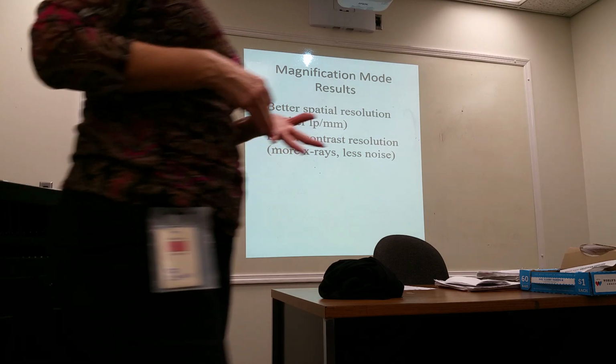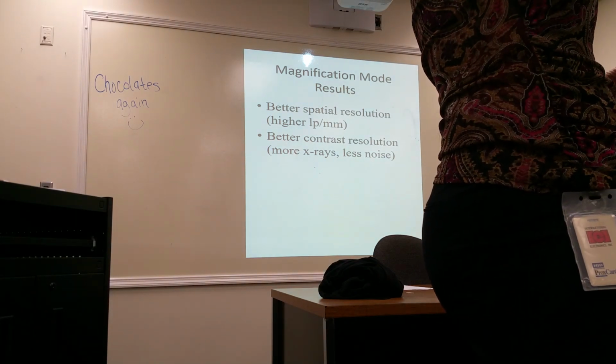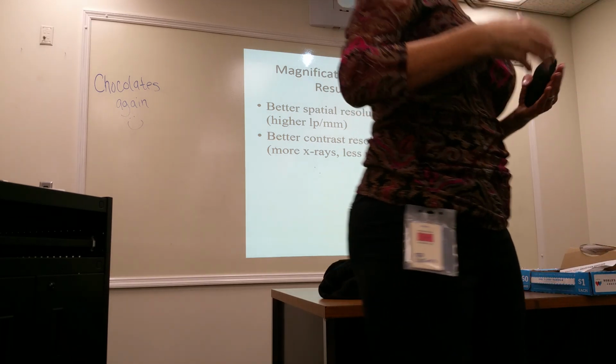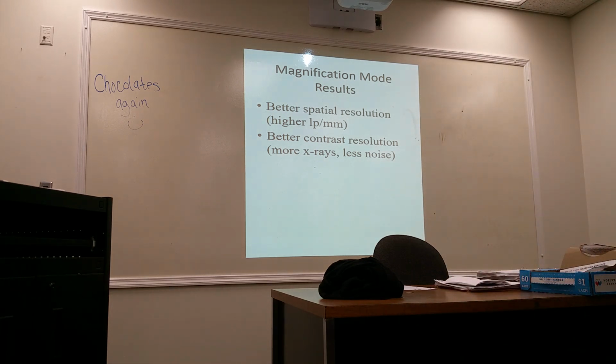And isn't that true in CT also? That's where they get in trouble in CT, because the higher the mA, the better the image resolution is. Whoever's taking the x-rays, that's what they tend to do to get better images. So there's a balance there. You've got to find that fine line between too much radiation and the quality of the image.